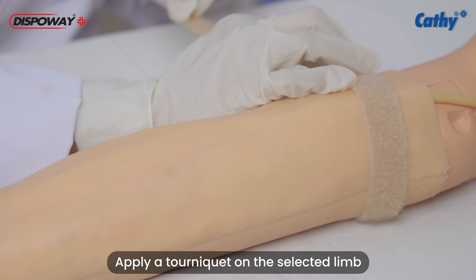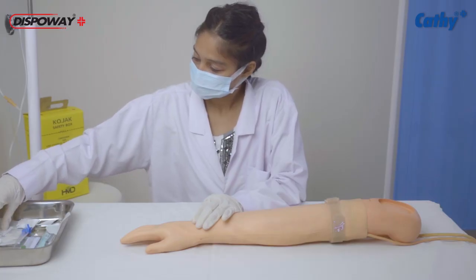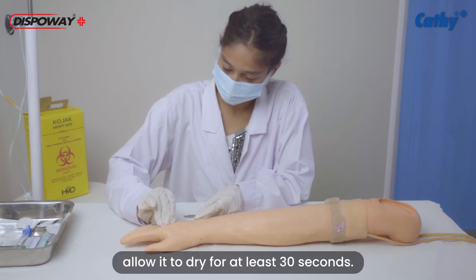Apply a tourniquet on the selected limb to induce venous dilation and facilitate cannula insertion. Thoroughly clean the injection site with an alcohol swab and allow it to dry for at least 30 seconds.